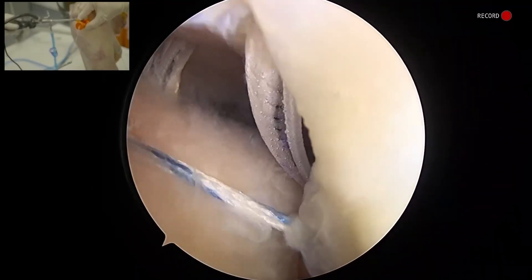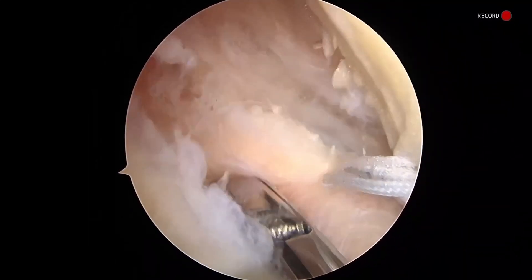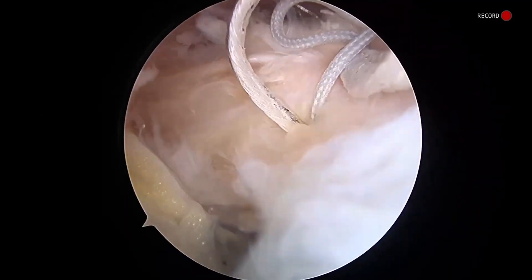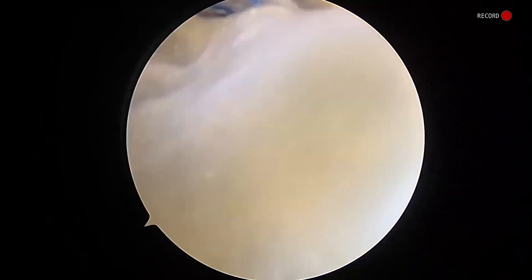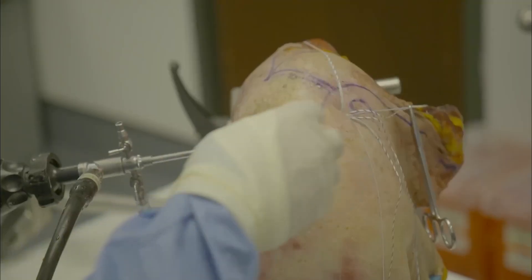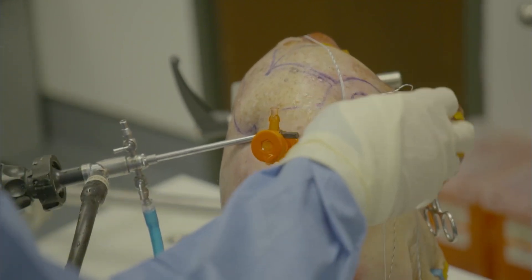I'm going to pull straight back out, going posterior to our last pass here. Once we're happy, we'll go ahead and fire that. Once again, we're going posteriorly to our previous pass here. Fire that out. Now we've got our various sutures passed, and now we're going to begin bringing them out for our lateral row.